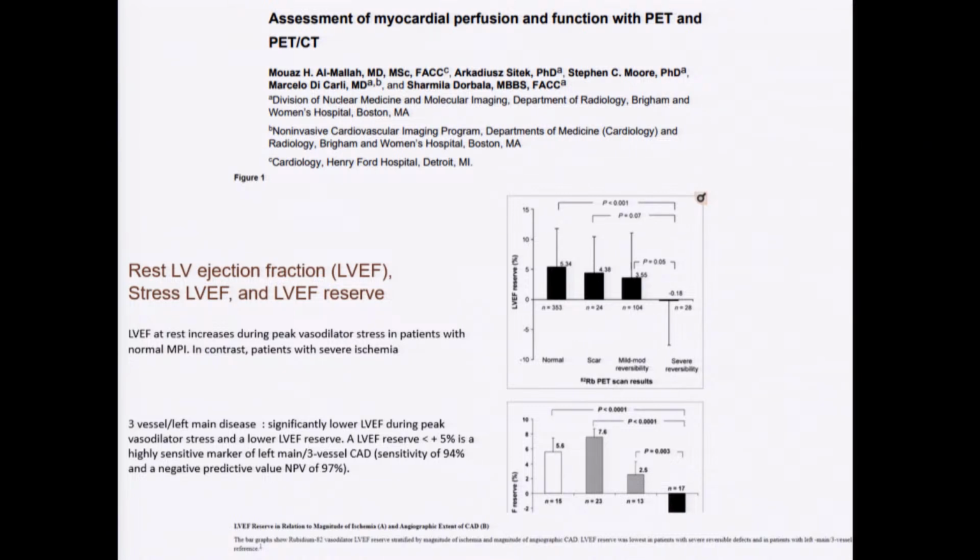So not only do they help you avoid false positives with the artifact, in certain cases they can help you avoid a false negative study, okay?